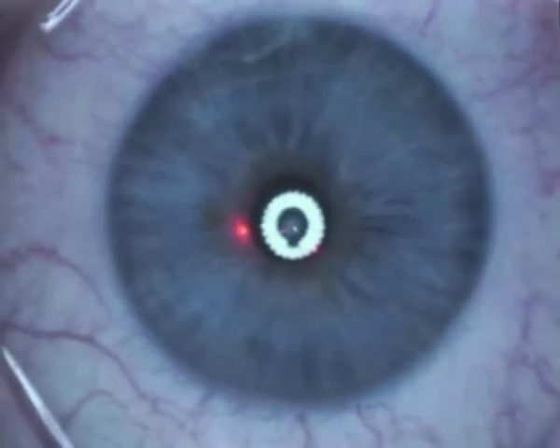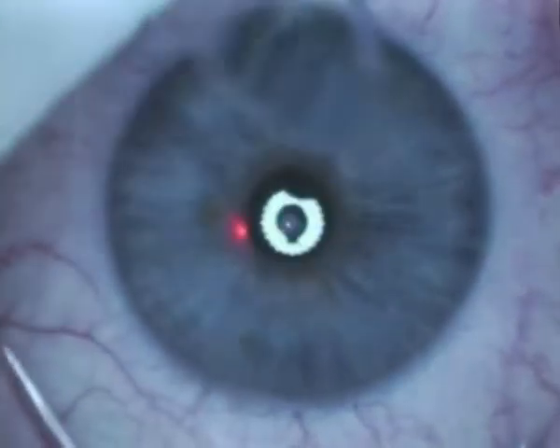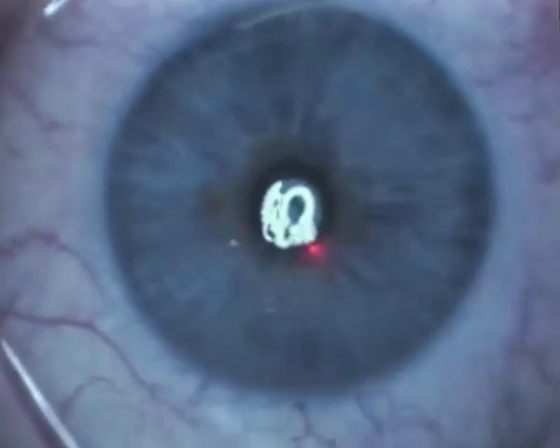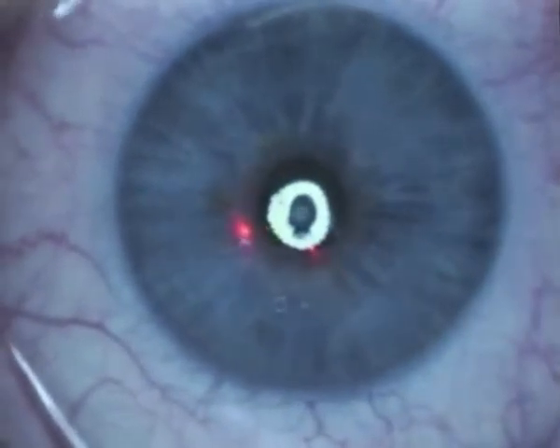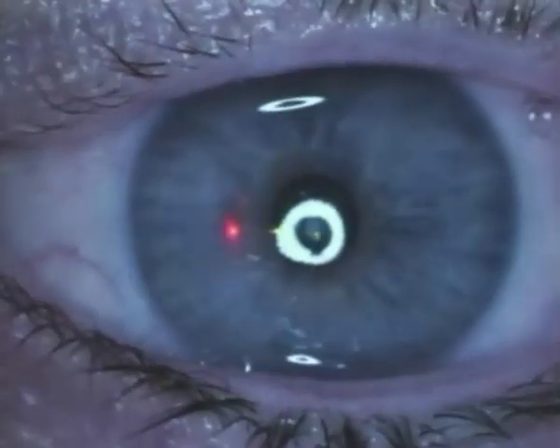The coefficient of friction of this lens is very, very low, and the base curve of 8.8 means that we virtually never get binding of the contact lens with hypoxia and pain. And that's the end of the procedure. Thank you very much.